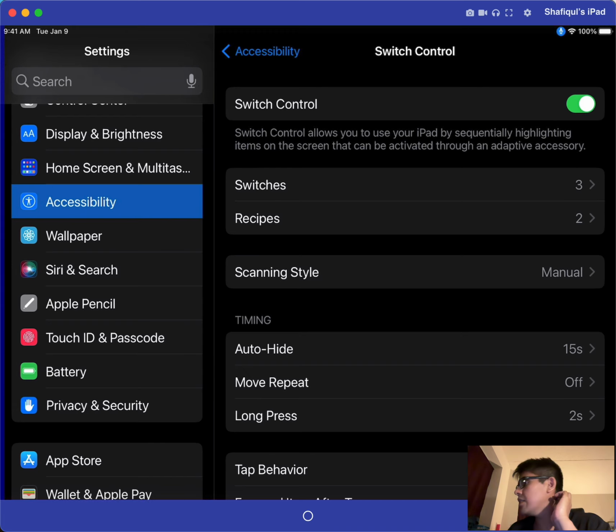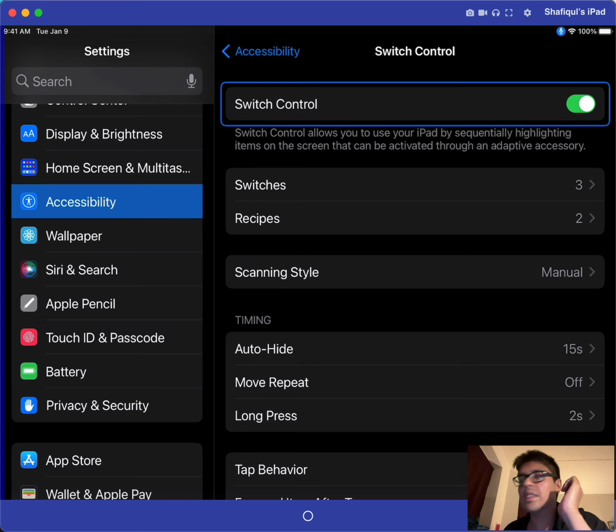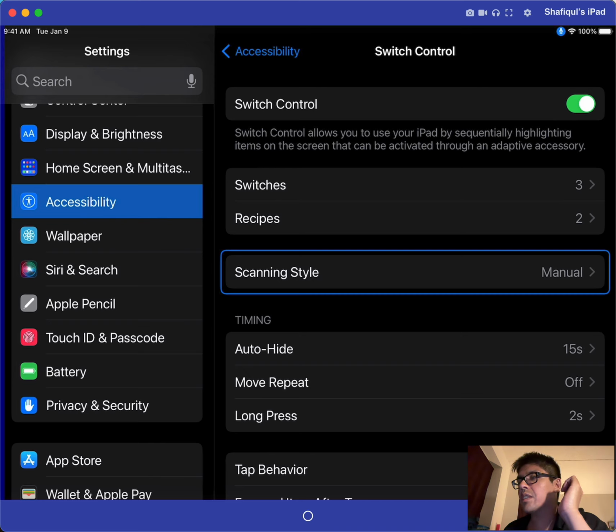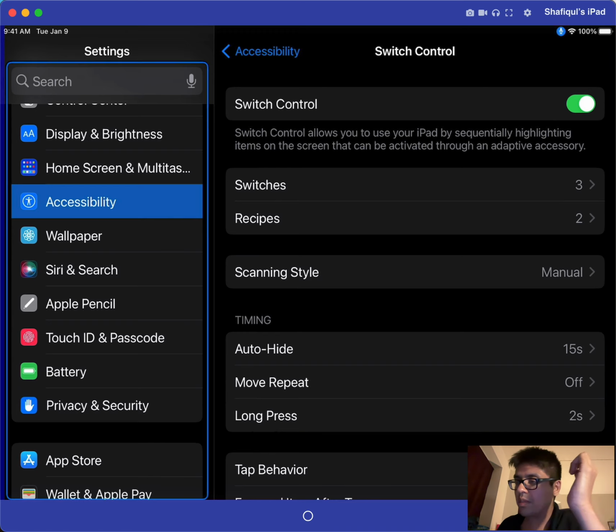So if I go to the right, I'm going to the left actually. Now it's able to select. So if I go down, well, let me go back up. It's not detecting my left head movement, but that's fine. Oh, I see the problem.